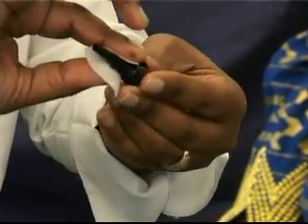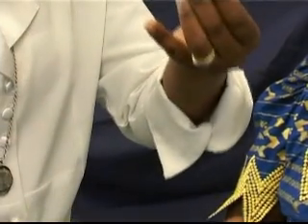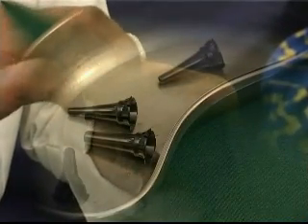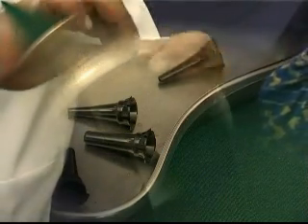The speculum should be washed in warm water prior to putting it into a disinfecting solution, either of 70% isopropyl alcohol or soaking in any recognized sterilization solution. Before using the speculum on the next patient, it must be removed from the solution, rinsed in clean water and dried thoroughly.